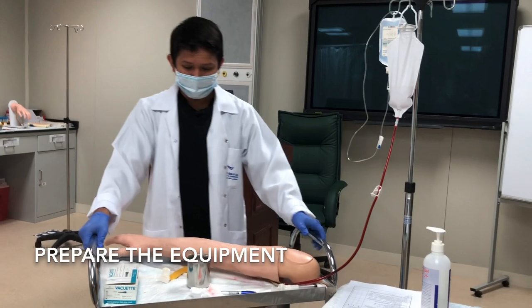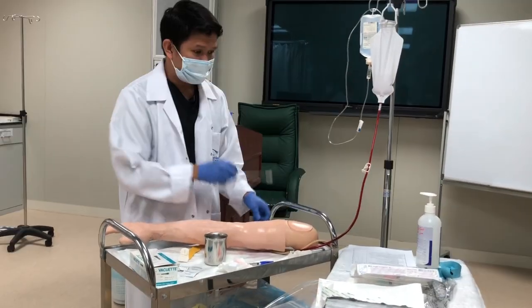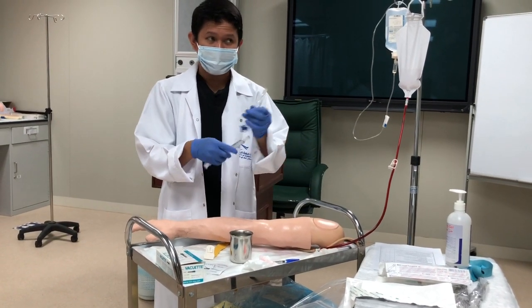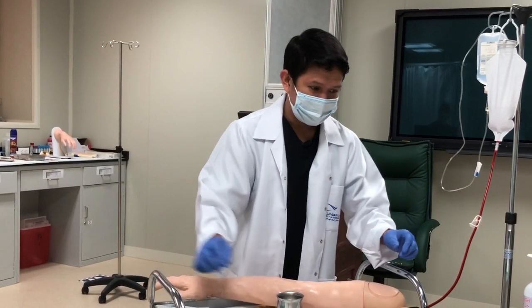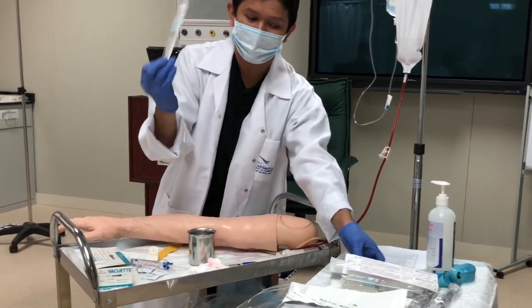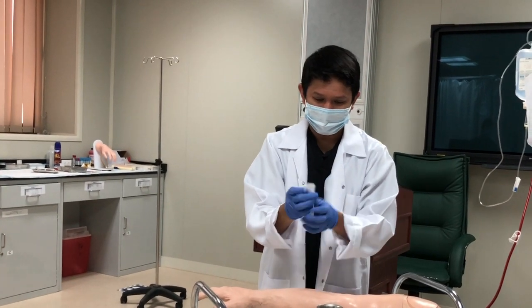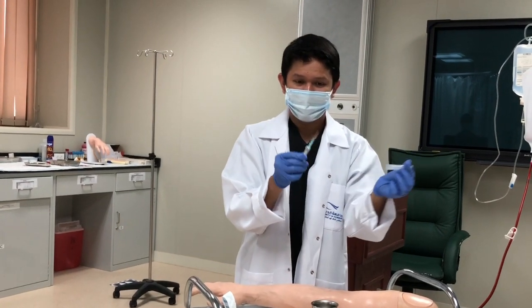Next, you need to prepare the equipment. You will need an alcohol swab, a three-way saline lock, and a flush — this is used to ensure patency. Next is your cannula. Open the cannula; it is either gauge 22 or gauge 20 for adults. Check the cannula.